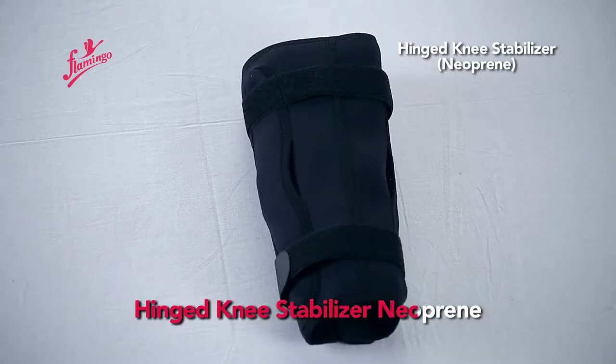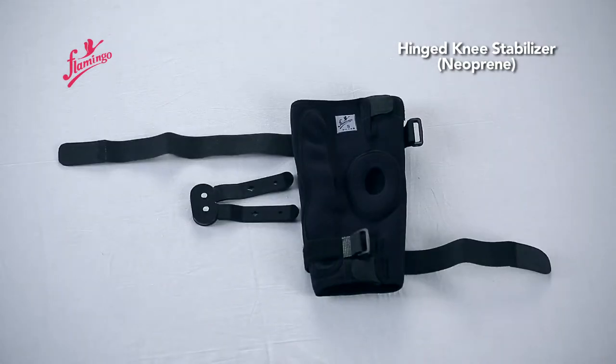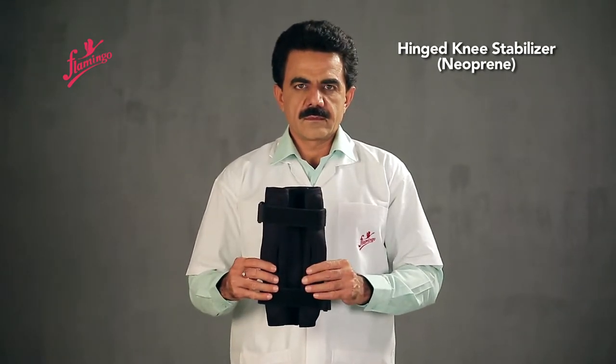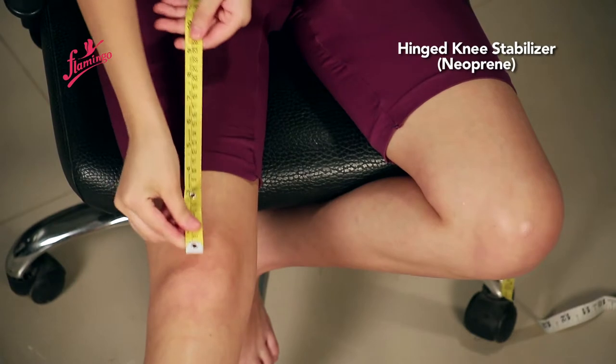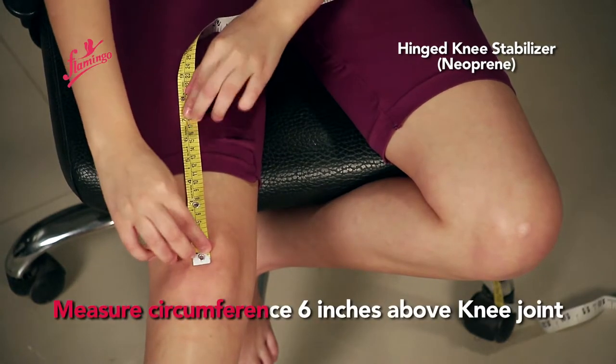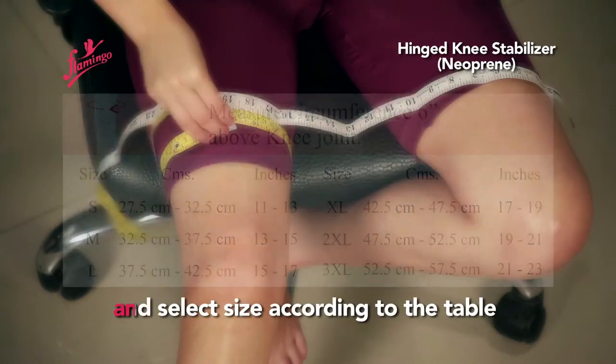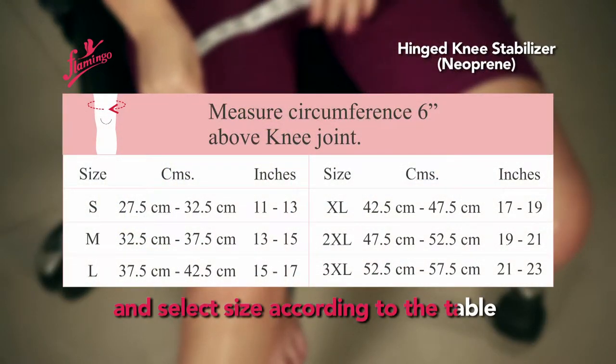Hinged Knee Stabilizer Neoprin. Measure the major circumference 6 inches above the knee joint and select size according to the table.